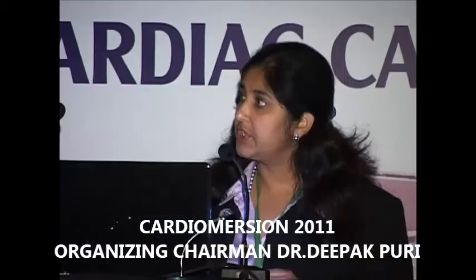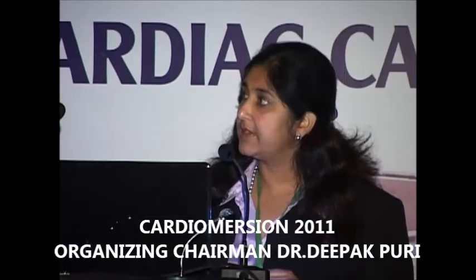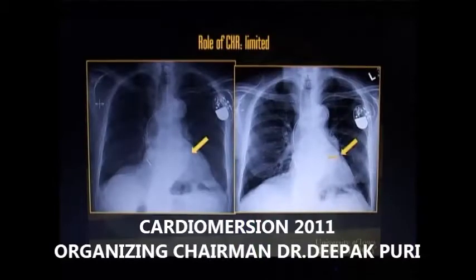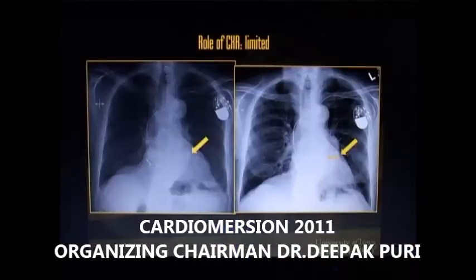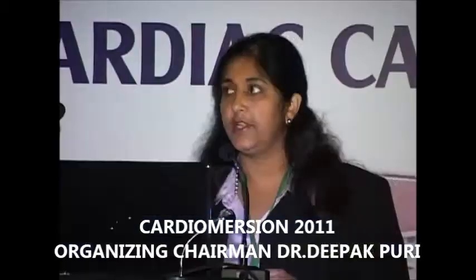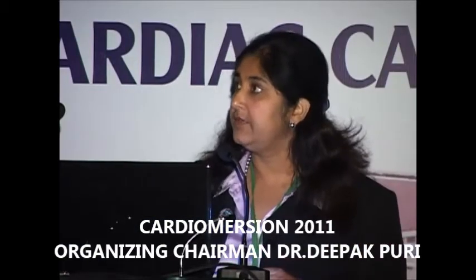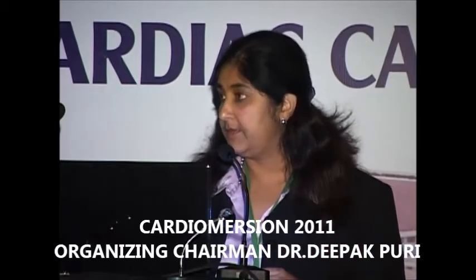If you visualize that the intimal plaque or the calcified plaque has moved inside, this is what his CT looked like. So between these two X-rays he had developed a large, contained rupture of his aorta. So X-ray, if looked at carefully, can sometimes be helpful, though it is not the sole modality on which anybody would rely. TEE is not my specialty, but I will quickly go over that.